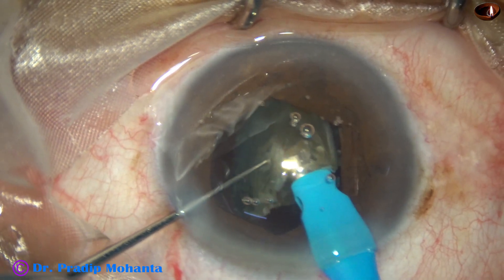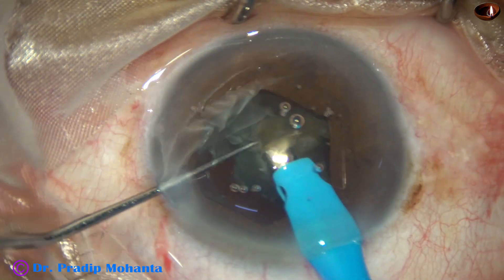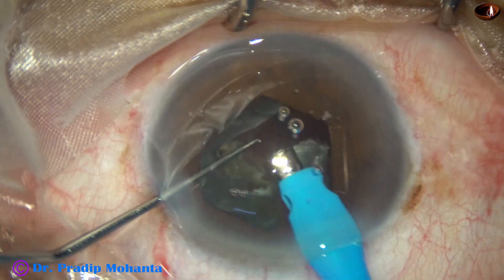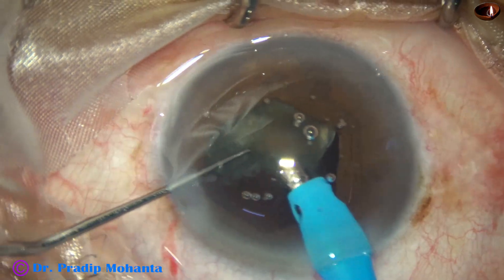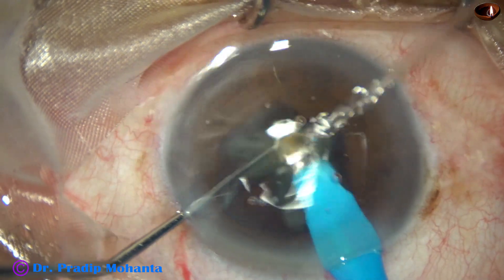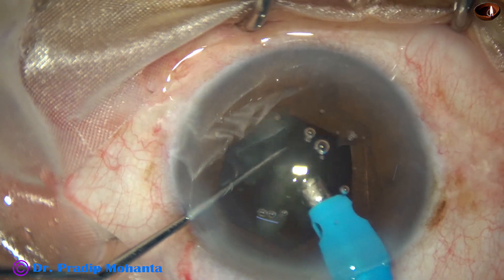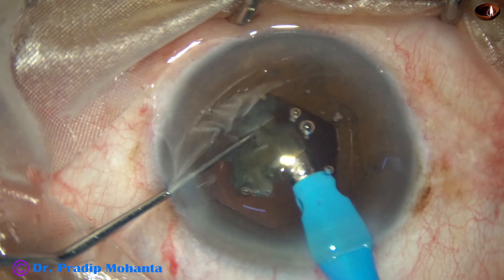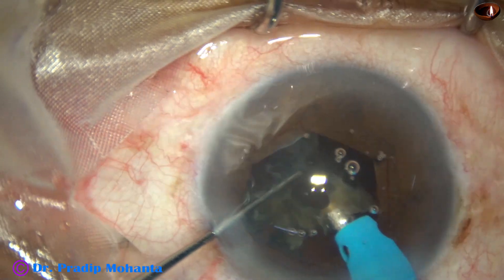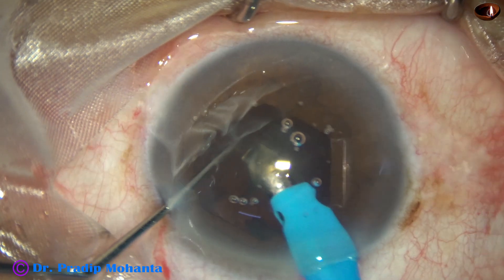This is the last nuclear piece. For the previous pieces I used 80 percent ultrasonic energy, 450 mmHg vacuum, and 45 cc/min flow rate. For the last piece, I reduce vacuum to 350, flow rate to 35, and ultrasonic energy to 70 percent. Slowly, with a lot of control, keeping an eye on anterior chamber depth, never going to the periphery or dangerous zone, the nucleus is carefully managed.